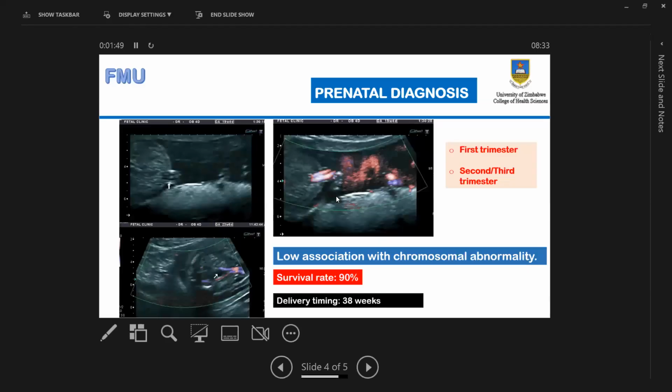What will the bladder do? The bladder will allow us to screen for the lower. Remember the upper, which you will describe more next week when you classify them, the upper abdominal wall defects, then the middle abdominal wall defects, and the lower abdominal wall defects. What I presented here is the screening of middle abdominal wall defects, which are gastroschisis and exomphalos. But when you come to this image on the bladder, we are now screening for lower abdominal wall defects.